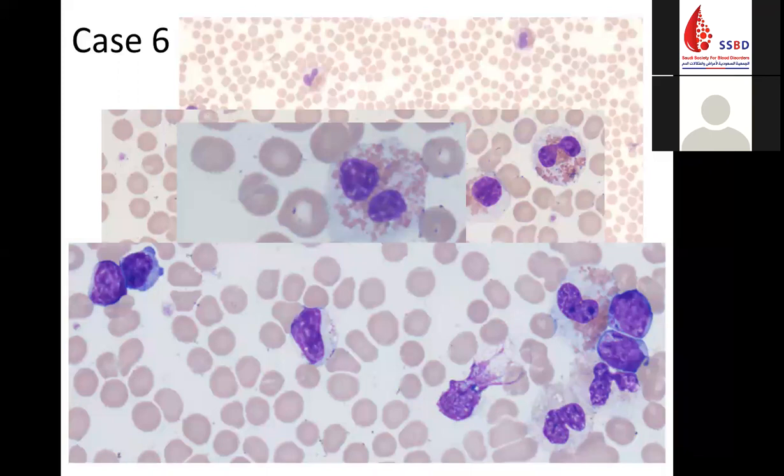So what do you think? Eosinophilia. AML could be with eosinophilia; you would like, for example, to put in your differential AML with inversion 16 and translocation 16;16. Yes, since there is eosinophilia, but we don't have monocytosis. So you need your immunophenotyping, definitely.